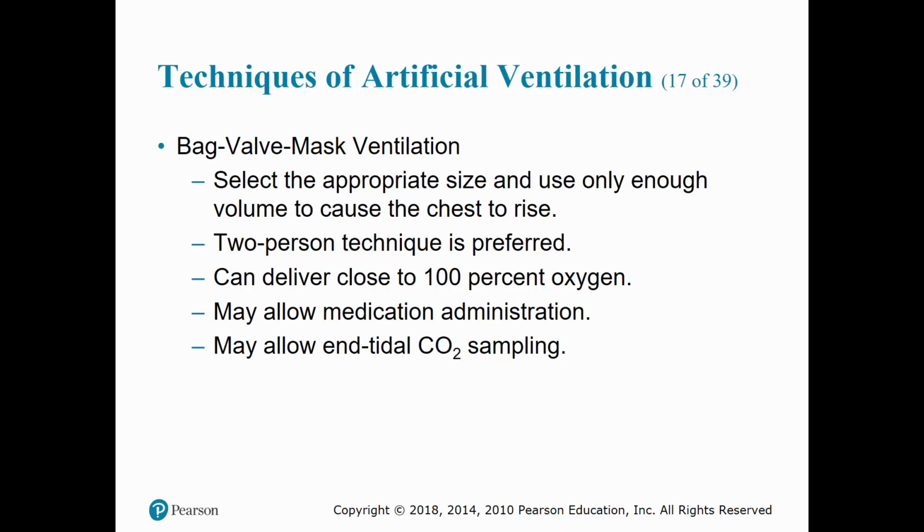With bag valve mask ventilations, one advantage of this device over the mouth-to-mask ventilation is its convenience for the EMT and its ability to deliver enriched oxygen mixtures. Also, if 2 EMTs are performing the procedure, one EMT achieves and maintains the mask seal with 2 hands, while the second EMT squeezes the bag to deliver the ventilation. The BVM device is harder to use than it looks, and the operator can become fatigued from performing a one-person technique.